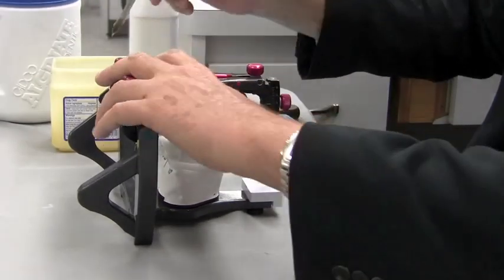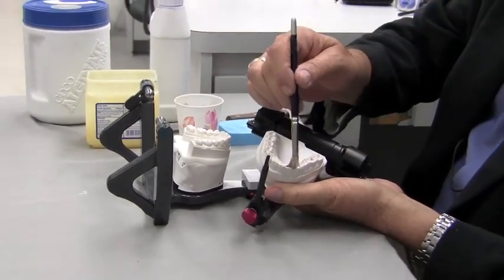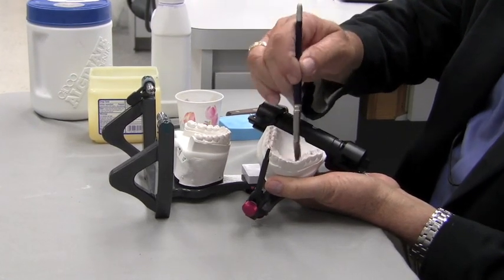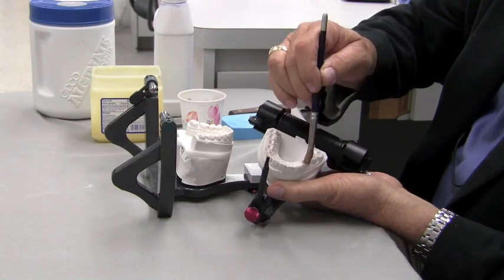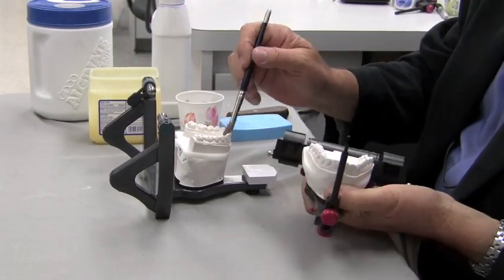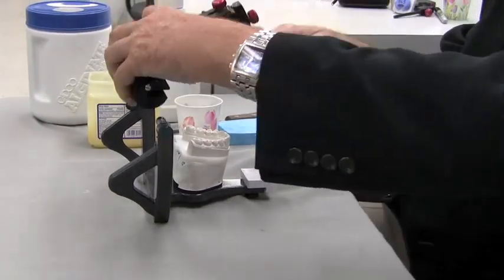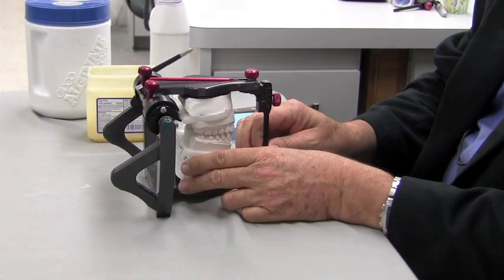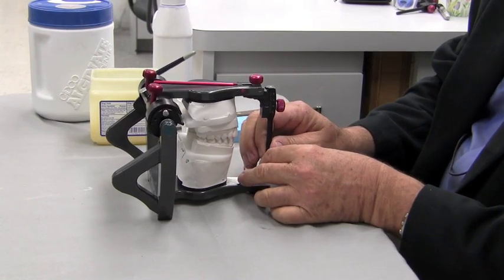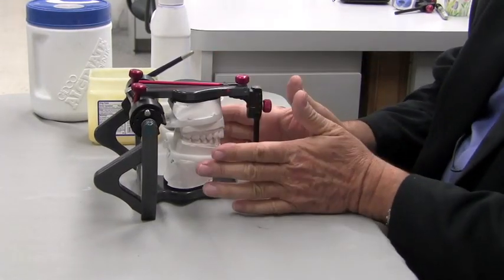The first step is to lubricate everything. I want to make sure that I put plenty of Vaseline on all these surfaces that are going to be grinding across each other — that would be the linguals of the uppers, cuspid to cuspid, and the incisal edges of the lowers, cuspid to cuspid. I'm putting a lot of Vaseline on here because I don't want to abrade away the stone and do damage to my models when going through the function, which would change my guidance. So I want to Vaseline that.